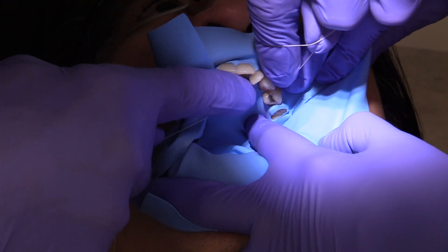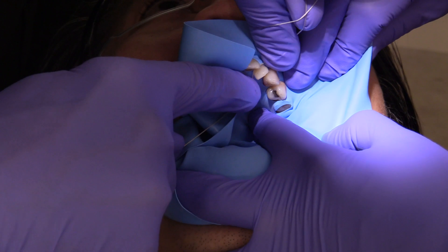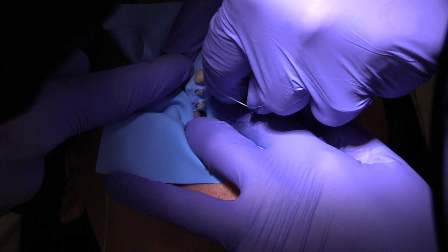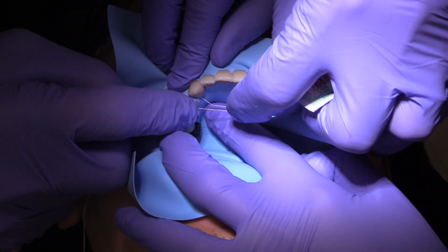I'm going in a situation where the dental floss is against tooth structure at all times, and that really makes the placement much easier. Now our patient Edward has very tight proximal contacts.